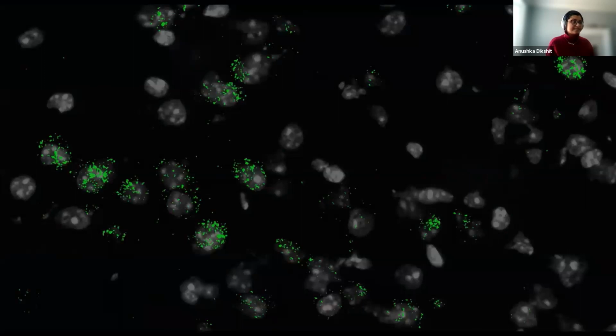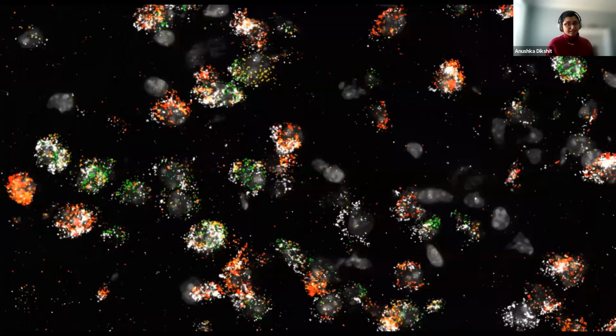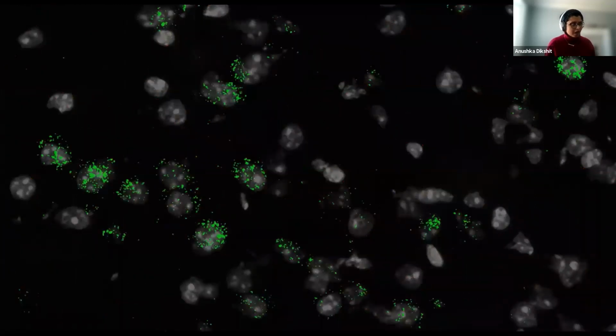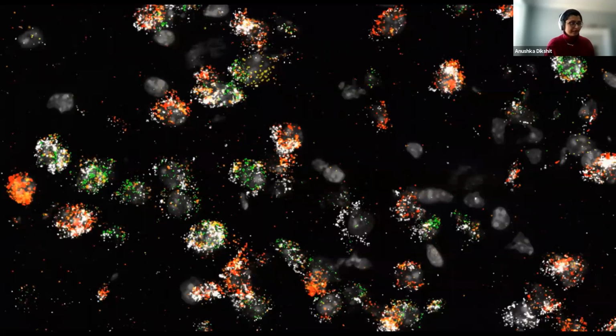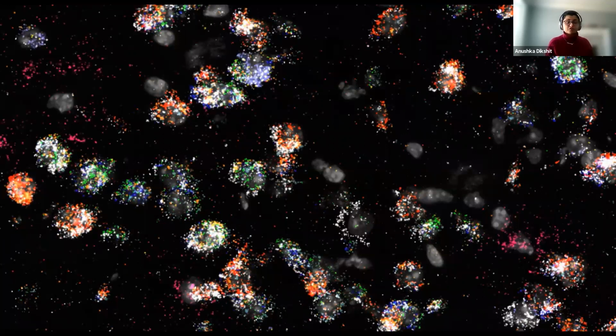So overall, what we realized is this assay is able to provide that spatial context which enables you to visualize your heterogeneous population of neurons in the same field of view and understand how they are distributed spatially within a section of the striatum here. So we just used this GIF and using our image registration software, created this beautiful image.